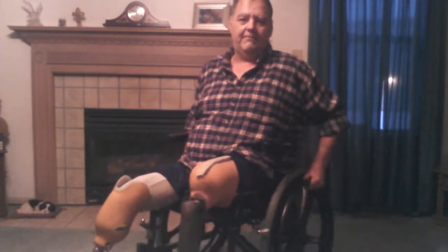Greetings, I'm Charles. I'm 55 years old, 6'1 when I'm fully assembled, and weigh about 230 pounds. Today I'm going to talk about taking off this above the knee prosthetic leg.